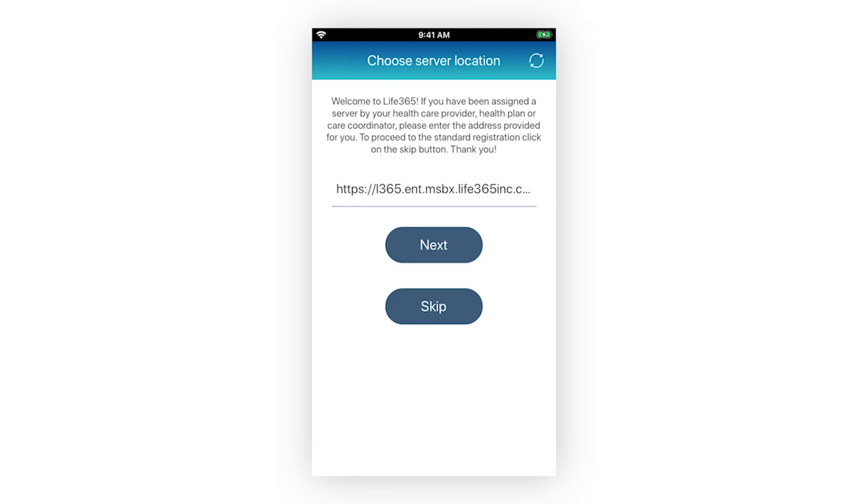If you are not associated with a healthcare organization, you are not required to enter a server address. Proceed with Life365's standard server address by selecting Skip.